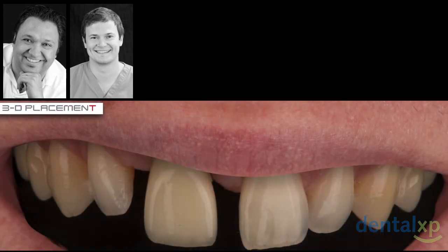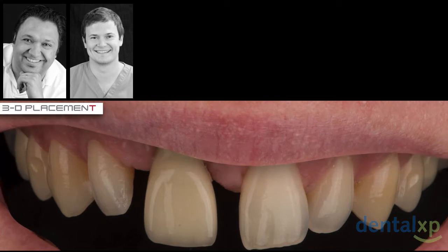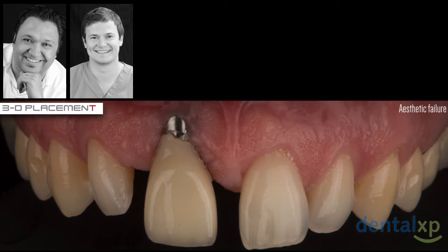So today, and I think we will all agree on that, we are facing a lot of implant failure. For example, in our office, 30% of the initial consultations are just for managing implant complications. And of course, failure is always the association of different factors. But believe me, there's one thing that is really common to all the situations: usually the failing implant is always positioned in the wrong way.